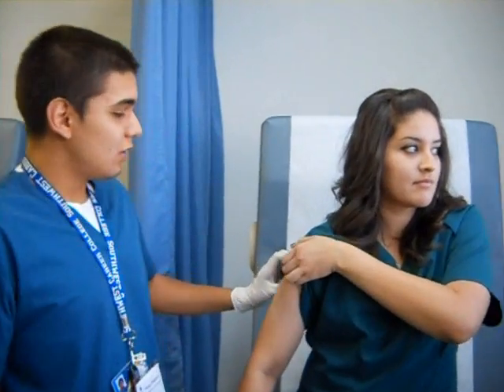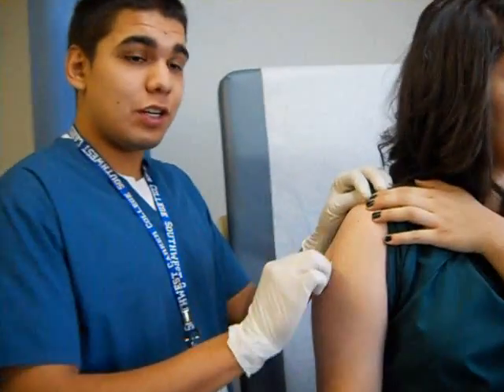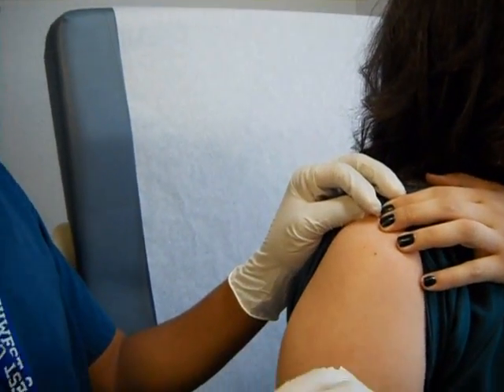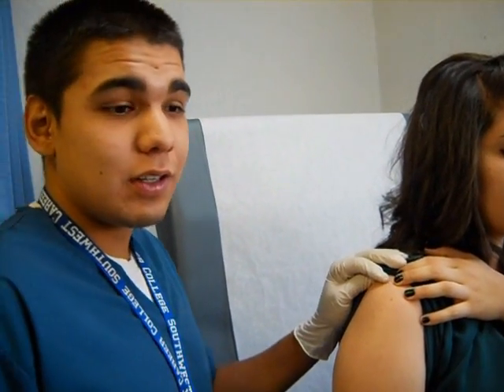After putting on your non-sterile gloves, start with alcohol pads. Always begin from the spot where you're going to inject and wipe outward in a circular motion. You don't want to wipe down the patient's full arm, but it's good to get a wide area.